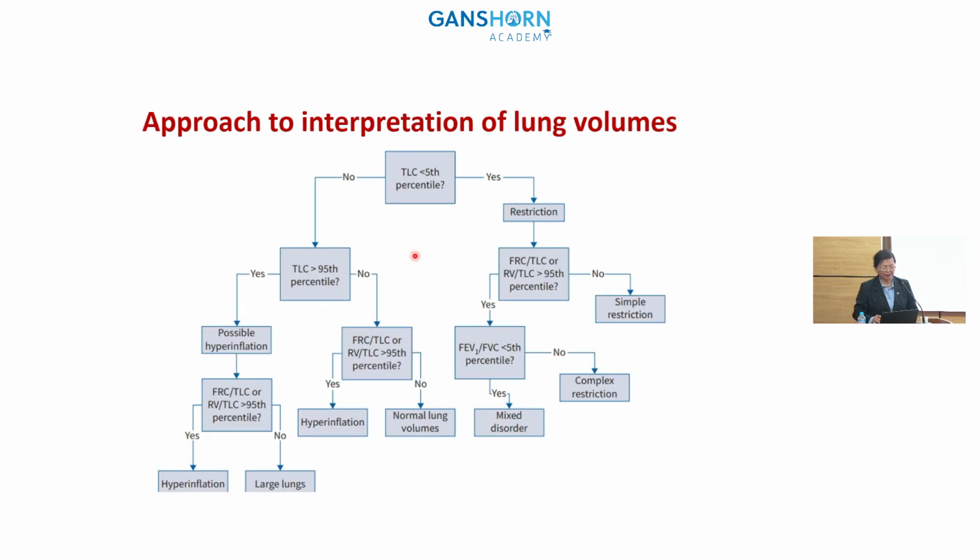For the interpretation of lung volumes, we will have hyperinflation, large lungs, or normal lung volume, or mixed disorder, or complex restriction. And we will follow this schema.